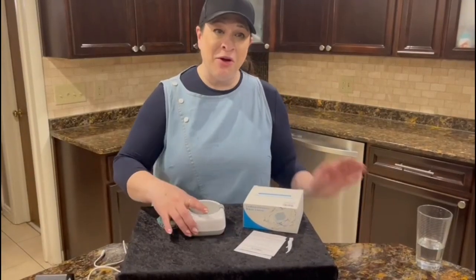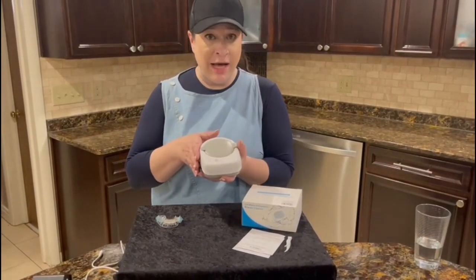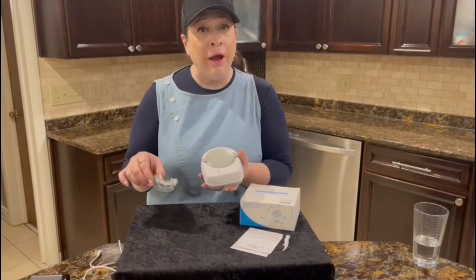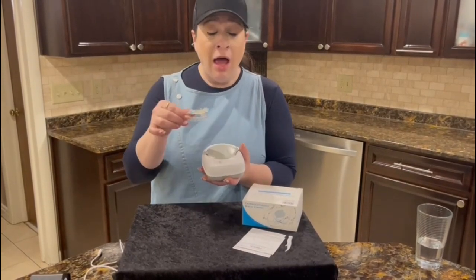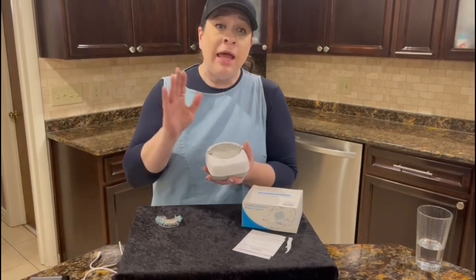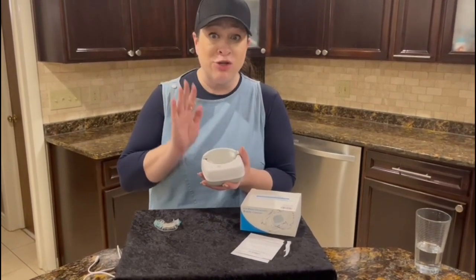Hi guys, I am here with this cordless ultrasonic cleaner. It works great for things like mouth guards and retainers. It's really made to work wonderfully with those items, and it is awesome because it's cordless.